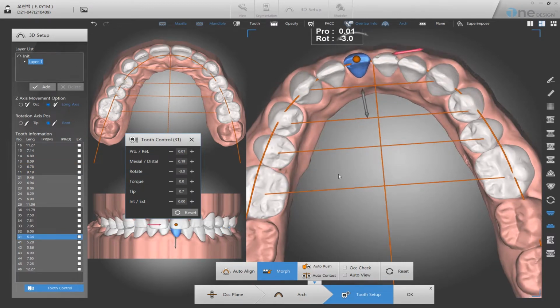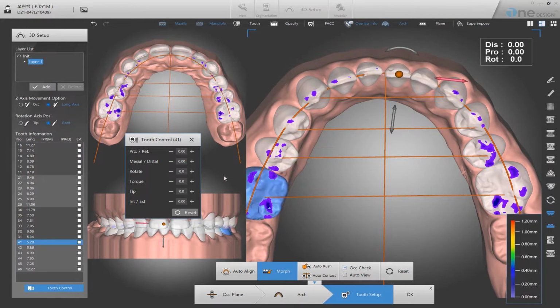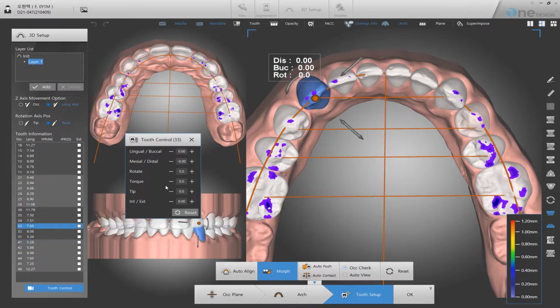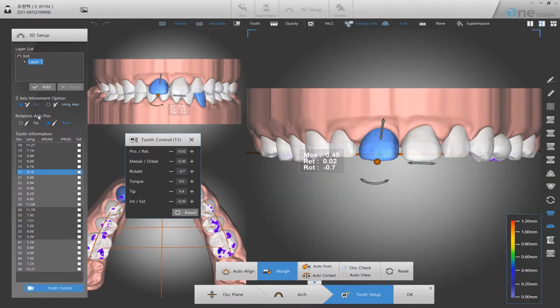In the mandible, we will perform rotation leveling using space. Incline the tooth to the labial side while applying plus torque to the root. Be careful about occlusal interference during retraction, since this patient has a very close occlusion. Correct the axis of the central incisor that is tilted distally.